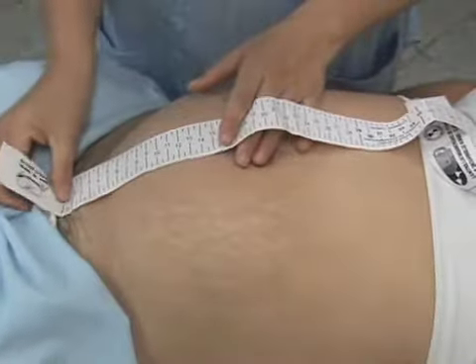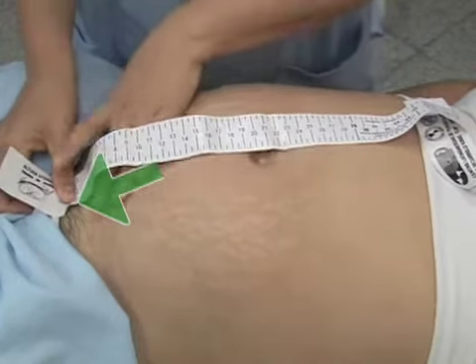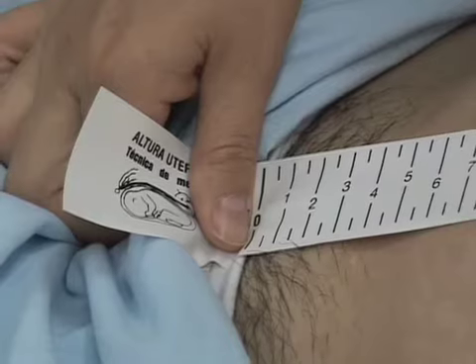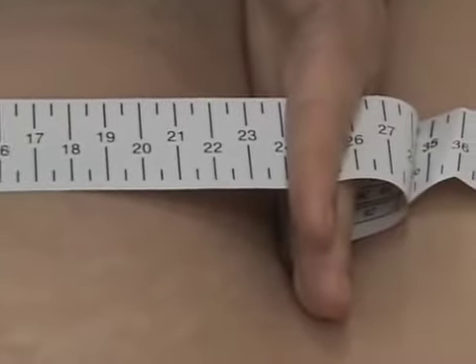Have the mother stretch her legs. Place the end of the tape measure, which reads zero, at the edge of the pubic symphysis. With the other hand, pinch the tape measure between the index and middle fingers and follow the curve of the abdominal wall. Measure the distance from pubic symphysis to the uterine fundus along the midline.